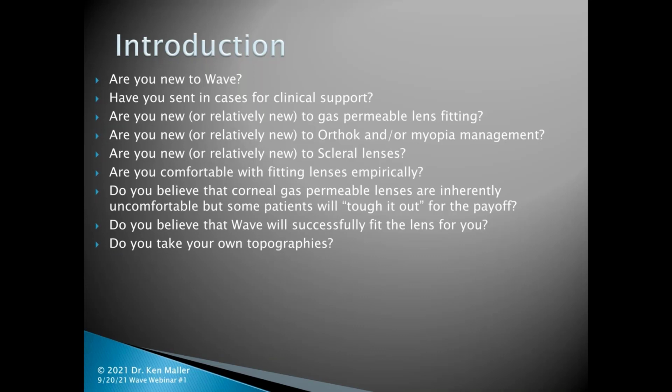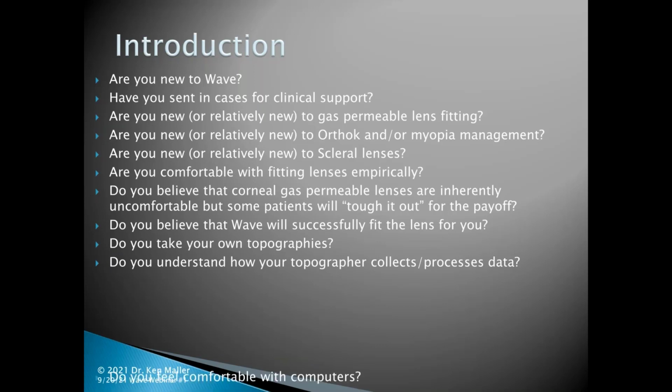And if this is something that is not possible for you to do in your office, and you are going to have technicians or other ancillary staff do this for you, you really need to provide proper training for them so that they can deliver proper topographies to you. Do you understand how your topographer collects and processes data? Understanding how the instrument works is really vital to being able to get data that you can find and believe trustworthy.